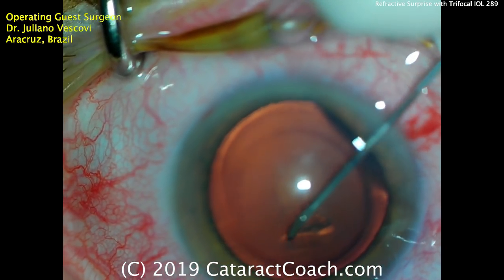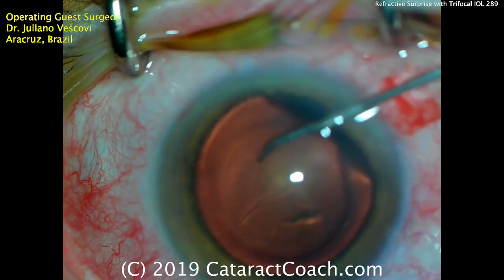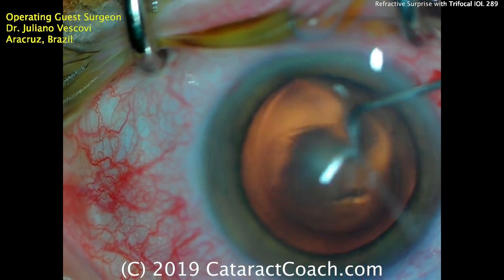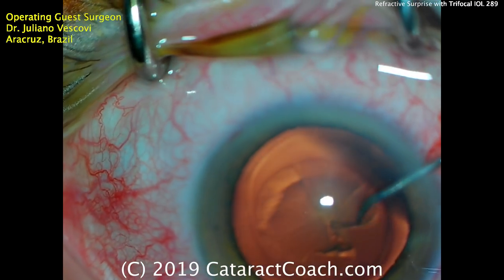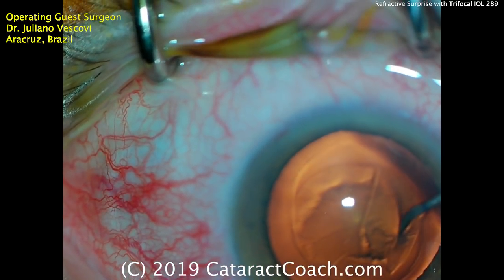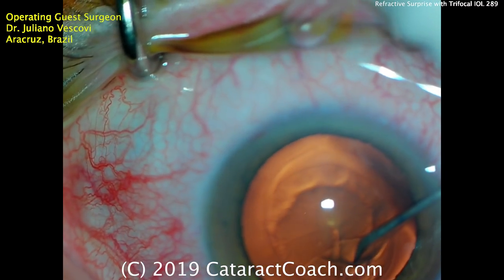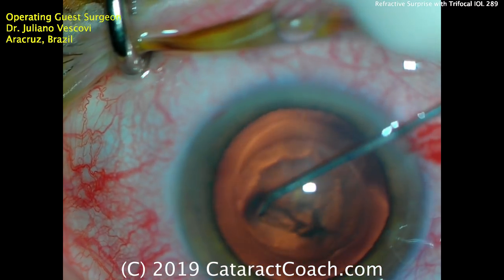A cystitome is being used to start the capsulorhexis and bring it around — that looks great. It looks like we're going to use the cystitome to complete the capsulorhexis as well. This is a technique that a lot of more advanced surgeons use; there's a lot of control in using just a cystitome, but this technique does require some practice. Clearly Dr. Vescovi is a very accomplished surgeon and does a beautiful rexis with just a cystitome.